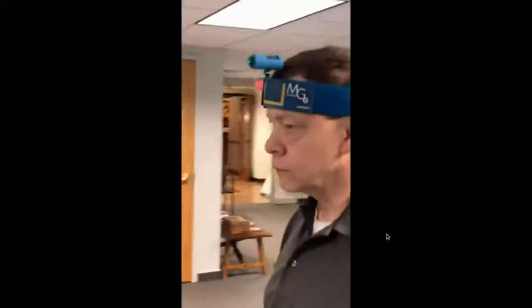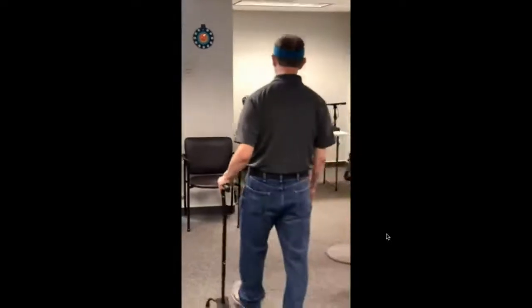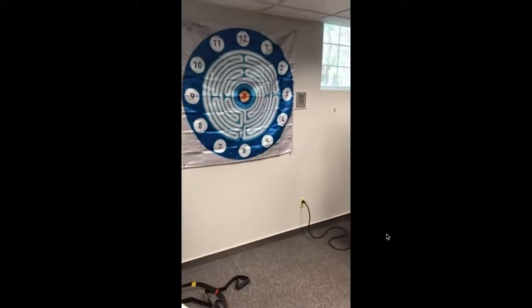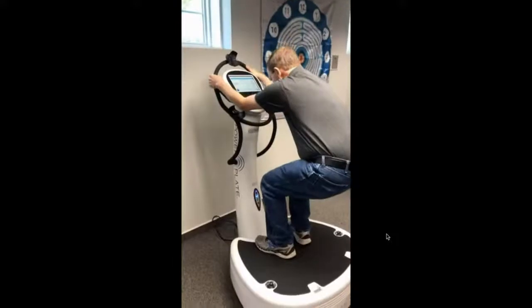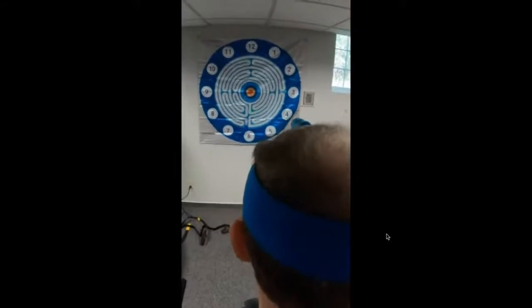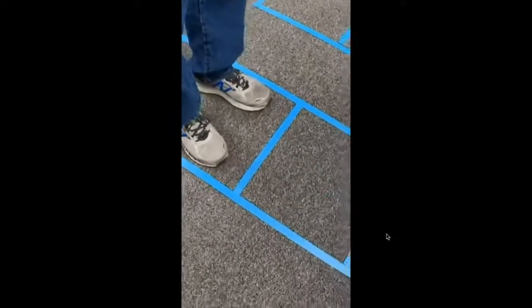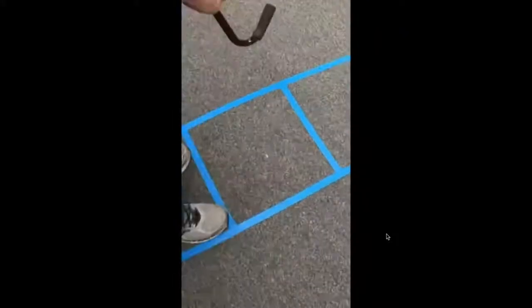He's trying to do a couple things here. He's working on recognition. He's working on body awareness. And he's also working on this freezing posture. So this is some cognitive overlay that he's doing, going back and forth with the laser. This is a different balance drill. But as he starts to make his way through the maze here, the report from the clinician taking the video was that the patient was able to improve their upright posture as soon as they turned the laser on.